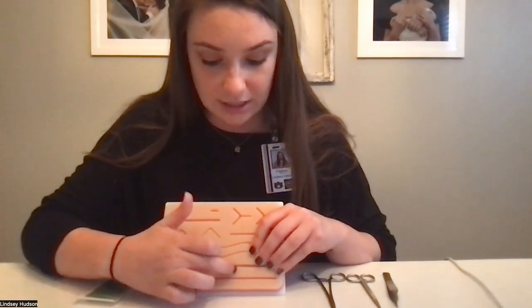So what we're going to do is draw up 1% lidocaine. We're not going to use lidocaine with epinephrine because it's not bleeding very badly. So you're just going to get 1% lidocaine drawn up in a 3 or 5 cc syringe, and then you're going to attach a subcutaneous needle. The way that you're going to inject this is with the bevel up, and you're going to go into the subcutaneous tissue and go all the way in. And as you pull the needle out is when you're going to slowly inject the lidocaine.